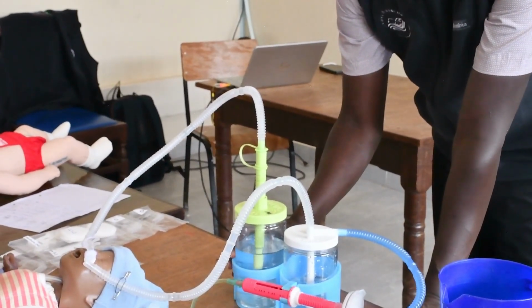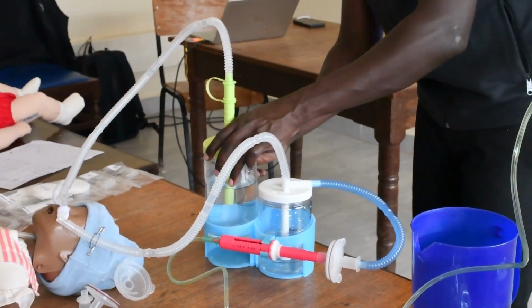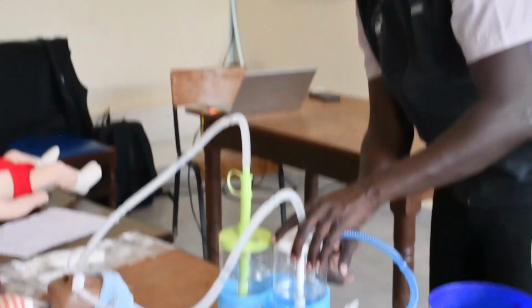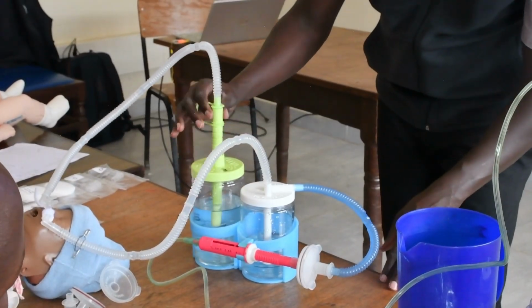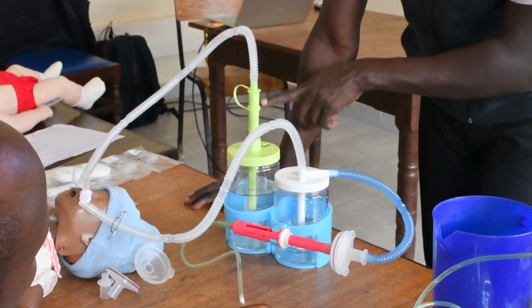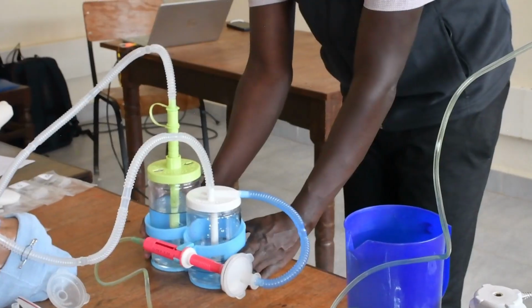Water level as well. Water level should be up to this fill line. If it is less than this, you refill. After 24 hours, you discard. Same thing for the filter. After 24 hours, you discard. If the water levels are less, make sure your pressure is appropriately set to the desired pressure you want. If you have set it at 5, make sure it is at 5. If it is at 6, make sure it is at 6. So this is the device monitoring.